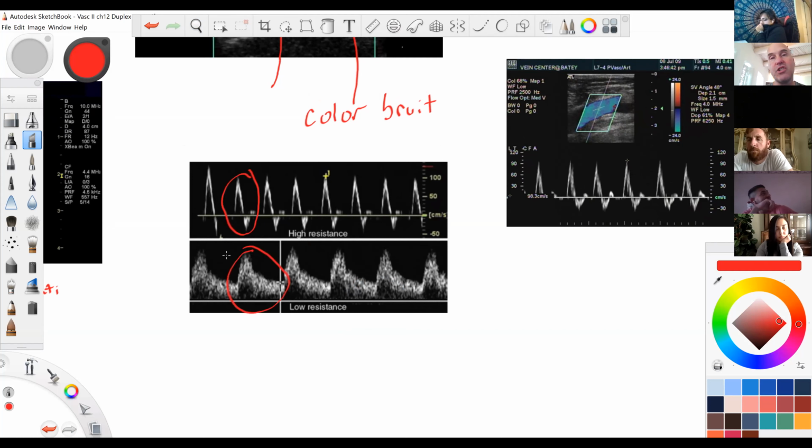Okay, did the patient just exercise? If they exercise, if you had them jump up and walk up and down the hall, do some squats or whatever, this is good. Their leg goes from this to this very quickly. And in a healthy individual, this happens very fast. All the arteries open up. They're like, come on, come on, come on, give me all the blood you can. I'm working out here. If this person is at rest, that is a really bad sign.